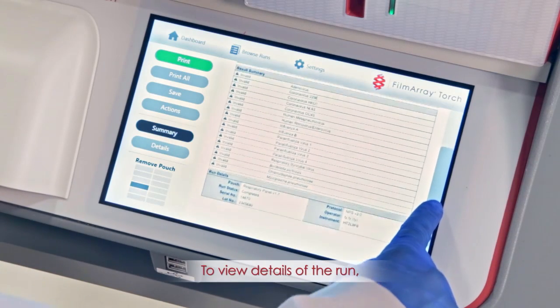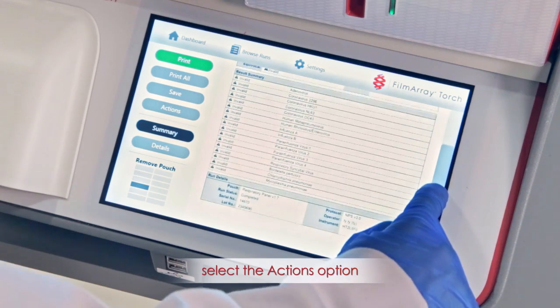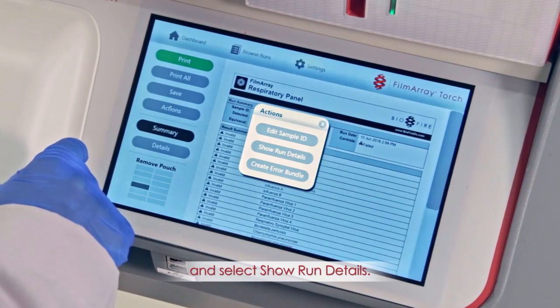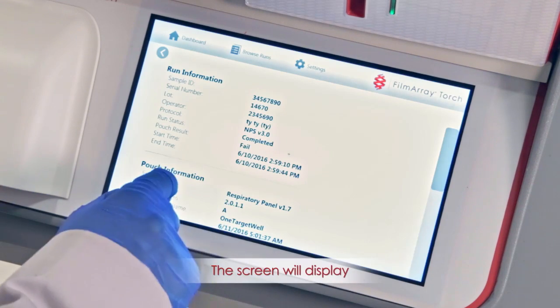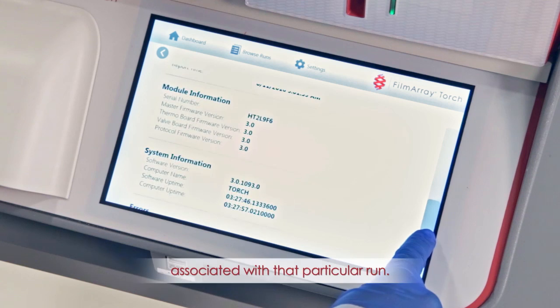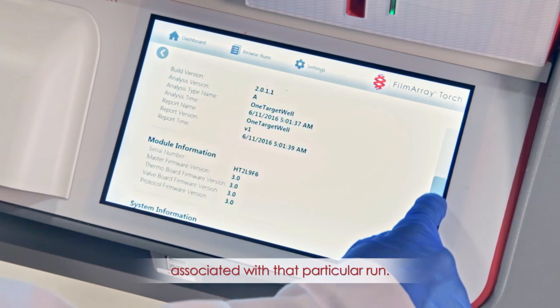Show Run Details. To view details of the run, select the Actions option at the upper left of the View Report page and select Show Run Details. The screen will display a list of the system details, messages, and errors associated with that particular run.